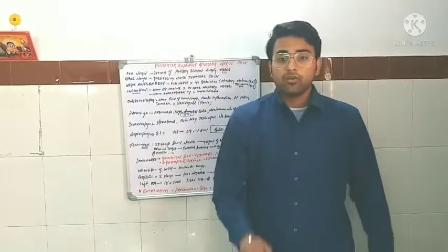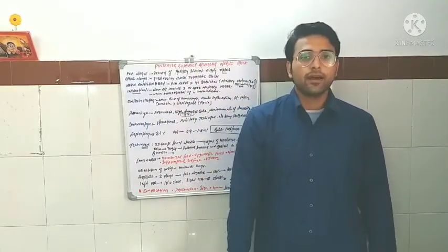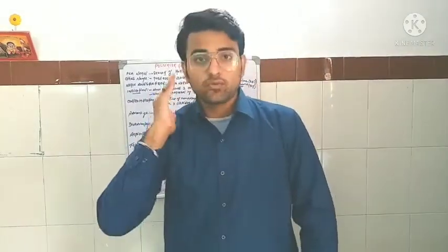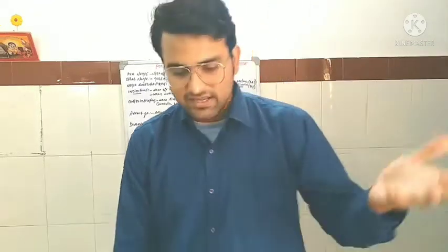So you have to avoid the chance of hematoma. Then you have to know that if it is too far posteriorly, it will also cause a problem: the bone will not be felt, and the syringe barrel will move backwardly. These cases are already discussed.